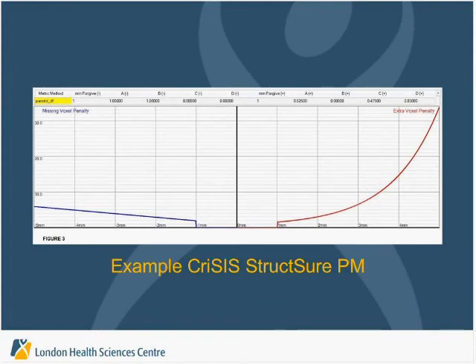So this is an example of one of the penalty metrics that we ultimately used, and this is for a parotid gland. Based on our discussions, we decided that if it was slightly under-contoured or over-contoured within a millimeter, we accepted that as forgiveness. As the parotid became under-contoured, there was an ever-growing linear penalty.